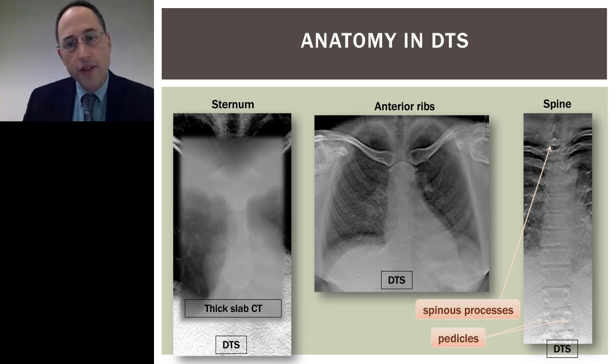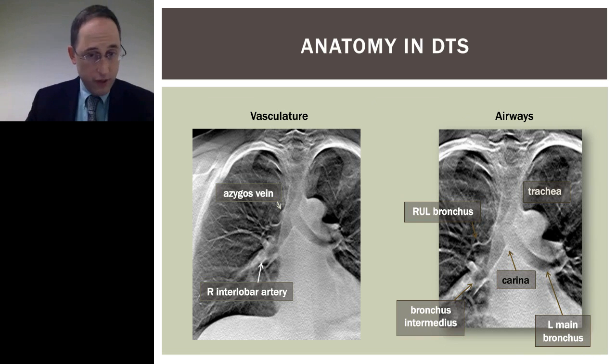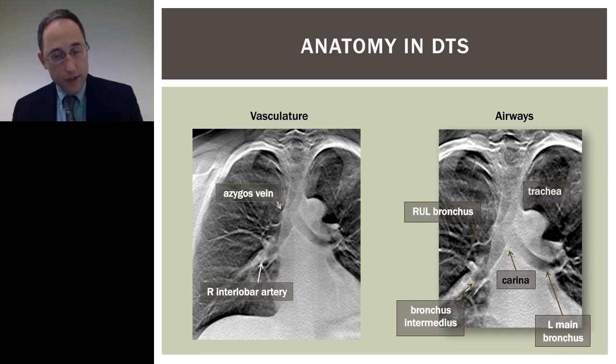Okay, let's look at some vascular and airway structures. Now I'm showing you a slice from the mid-chest.